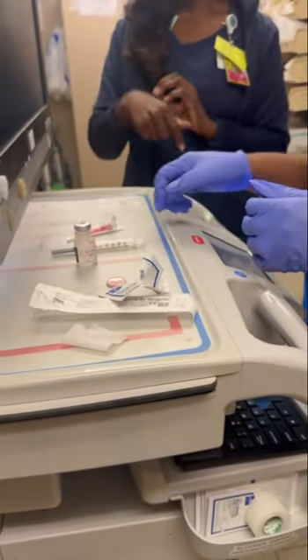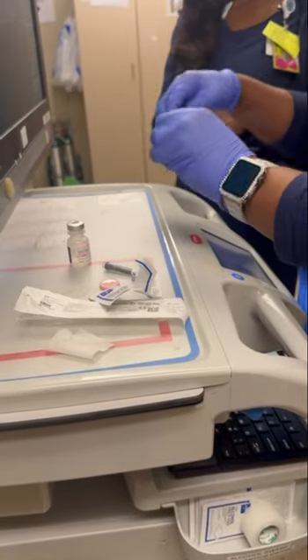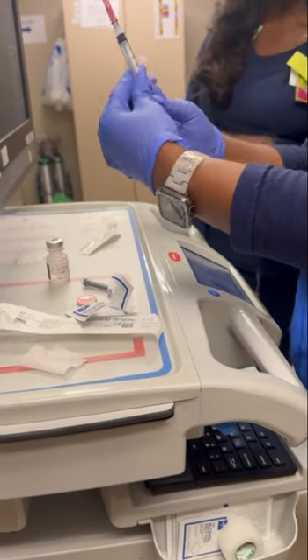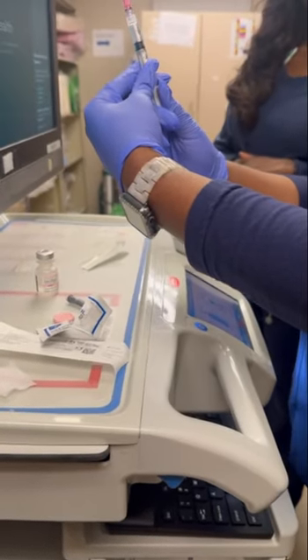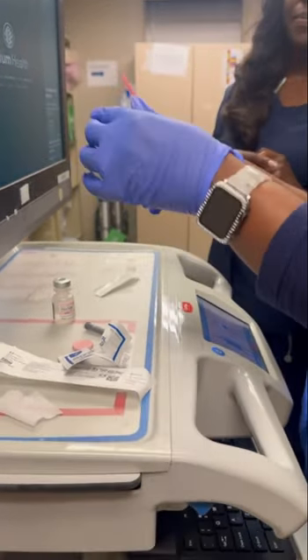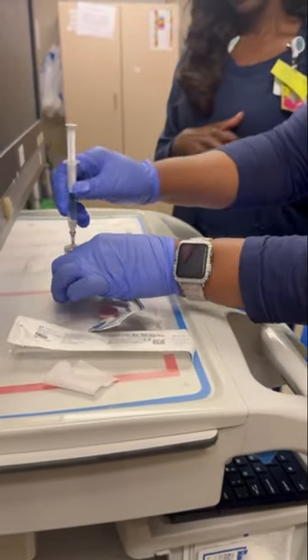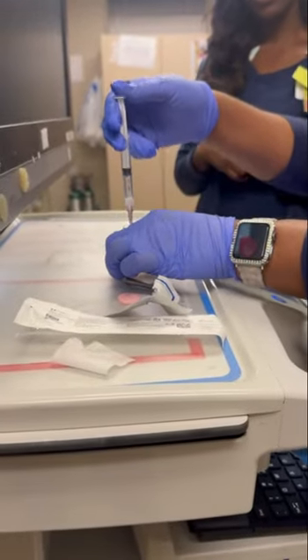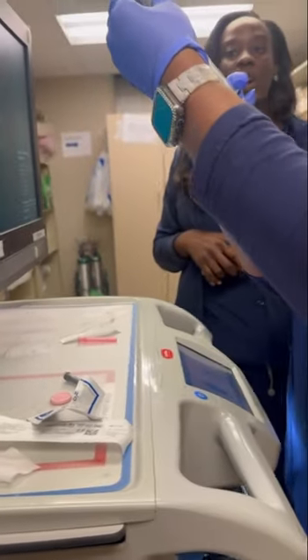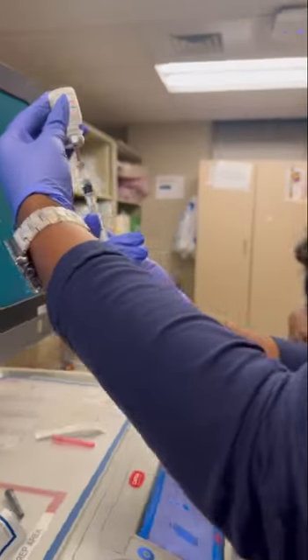Then we'll assemble our syringe. First, we want to pull back air — the appropriate amount of 1.5 mls. Then we'll remove the cap, place it to the side, and insert the needle into the medication with it facing down. Then we'll insert the air while it's flat on there. Then we will turn it upside down, make sure the bevel is up and in the medication, and pull back the appropriate amount of 1.5 mls.